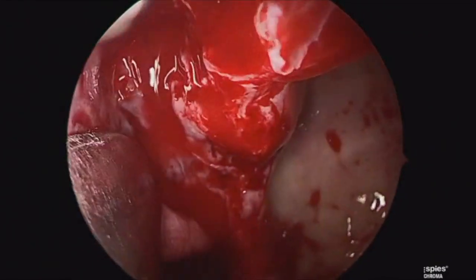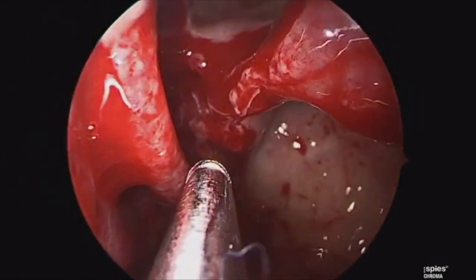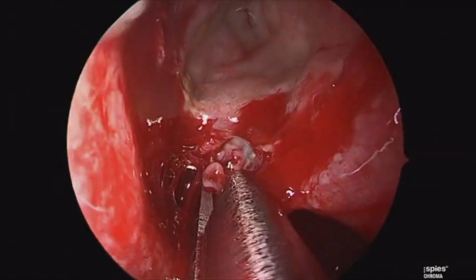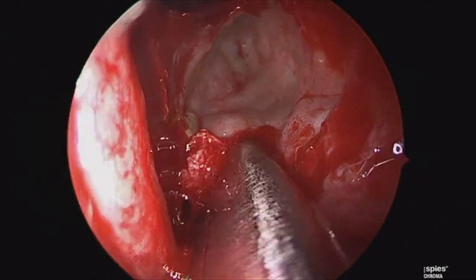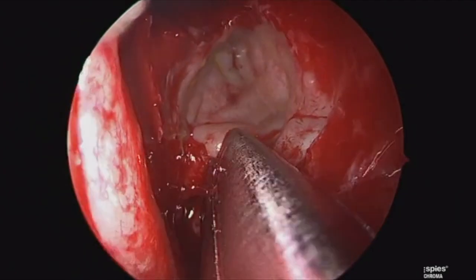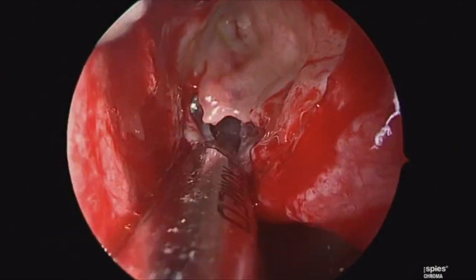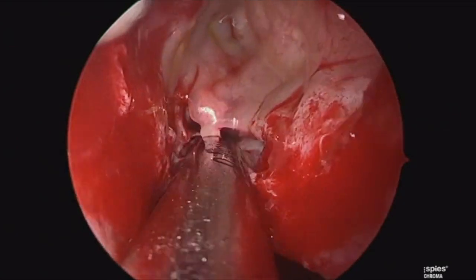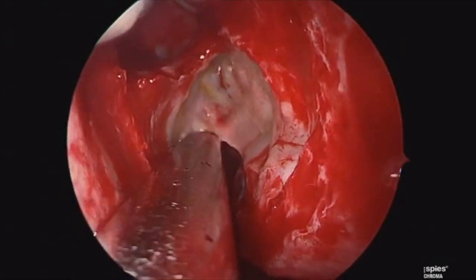At this point, we're going to cross through the basal lamella towards the posterior ethmoid cavity. We've elected to use our relaxing incision to cross through that area. Here we are with a two-millimeter curette, taking down that basal lamella from medial to lateral, and again looking for that lamina papyracea as we work laterally. This can be done with throughcutting instrumentation or a curette. Once that tissue is a bit more malleable, we can use a microdebrider to trim that loosened tissue. There's more polypoid disease here in the posterior ethmoid cavity, although I would still consider this to be a CRS without polyposis.